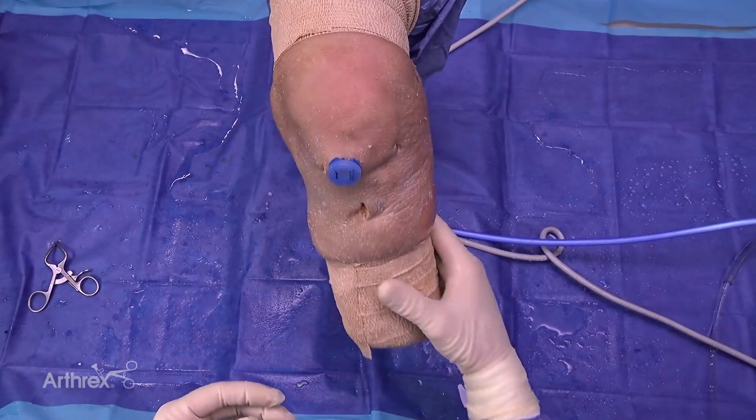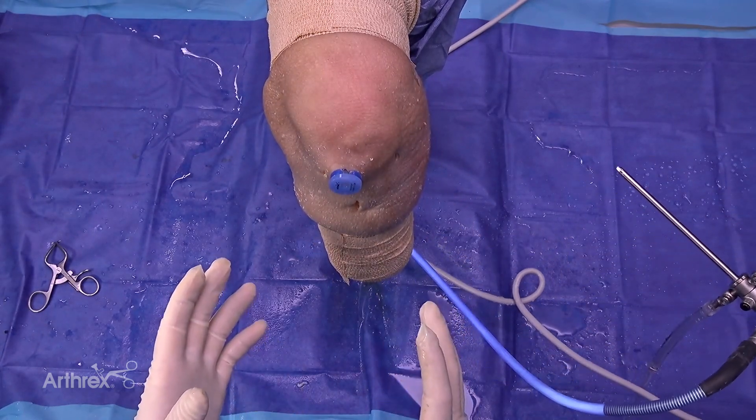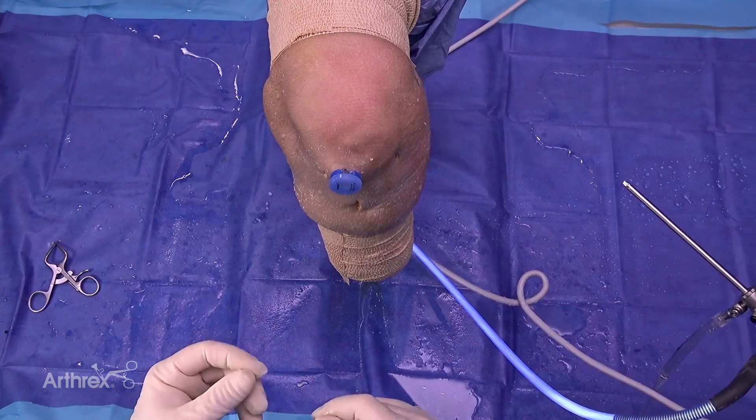That completes our internally braced ACL primary repair using the new swivel lock ACL repair kit.